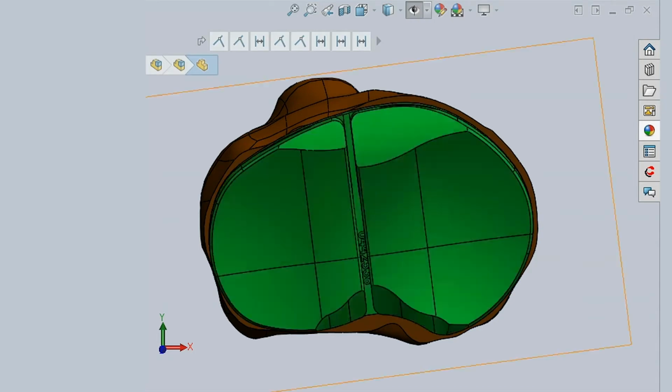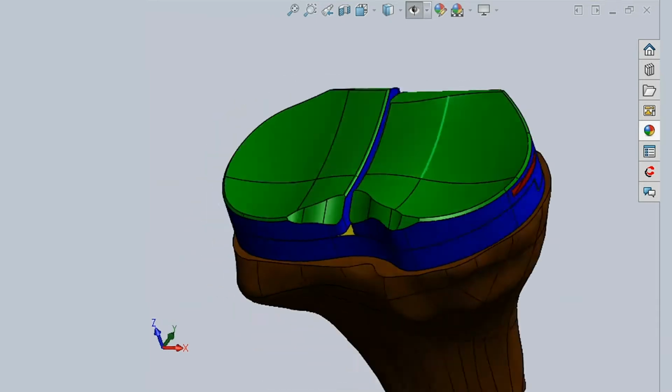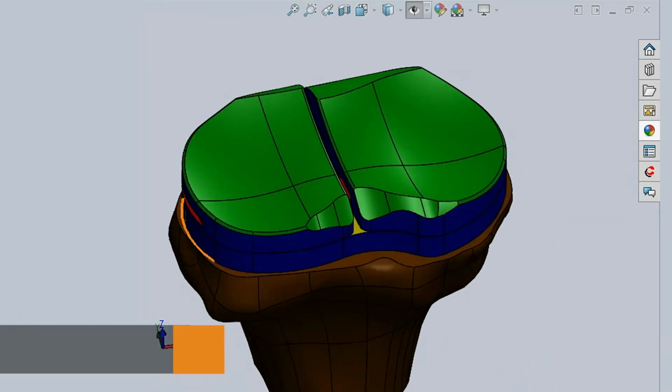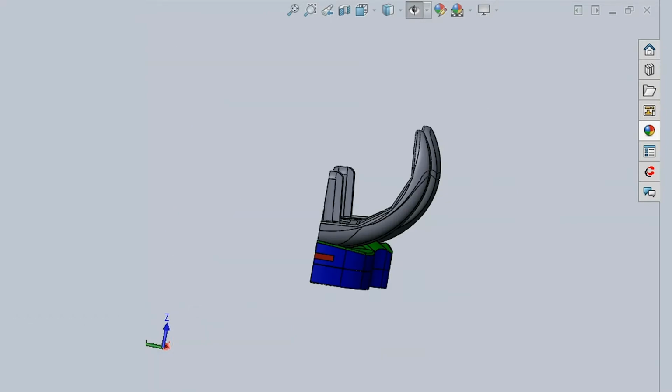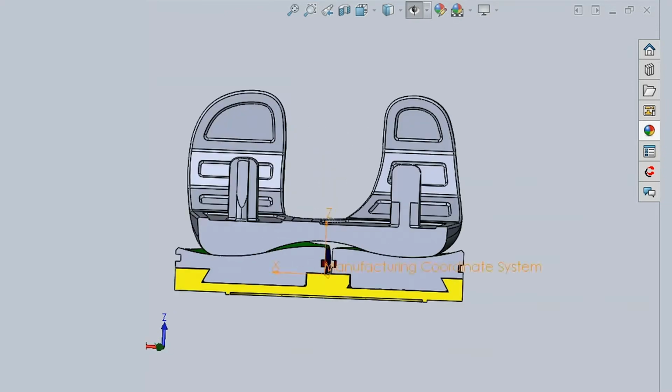And this sketch is again going to maximize coverage with no unnecessary overhang, and it allows for 5 degrees of rotation in either direction. Looking at this coronal cross-section, you can see the curvature of the poly is designed to match that of the femoral component. That offset is matched by the poly as well, which is going to restore the patient's native joint line.